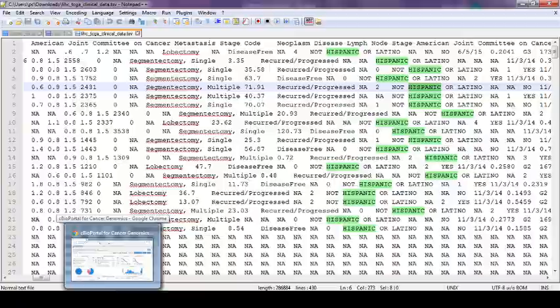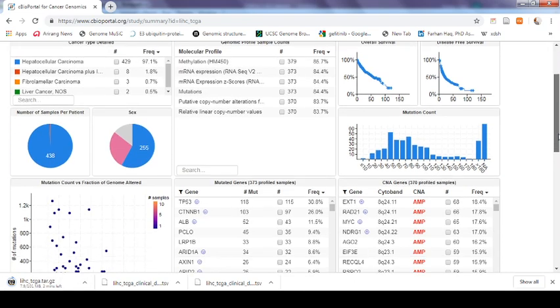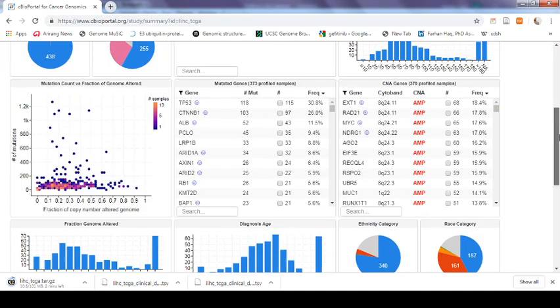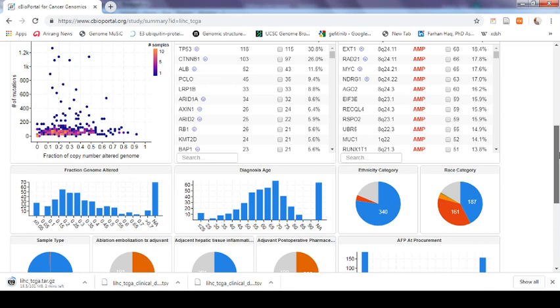Now this is the clinical information of each patient, and now we want to download the whole expression and copy number variation, all the information. You can just click here and you can see download all clinical and genomic data of this study. This will take quite a bit of time. For example, I just clicked it and you can see that this is a 101 MB file, right? So let it get downloaded and then we will discuss. When this ends, we can unzip this file and extract the information of expression.